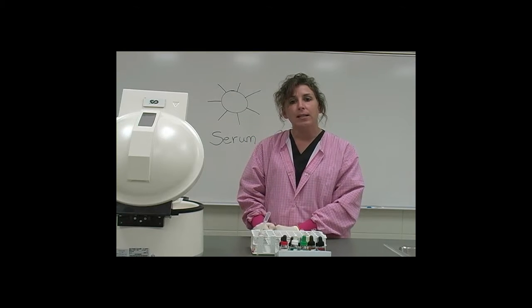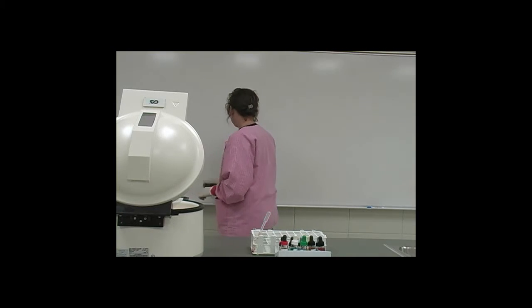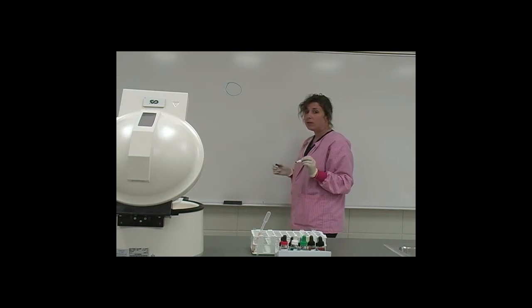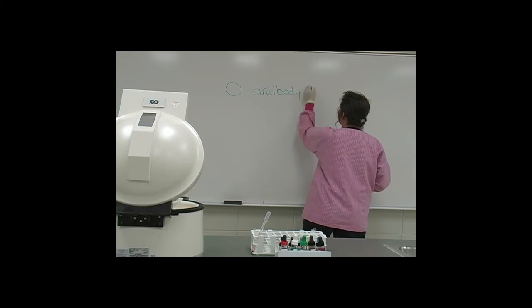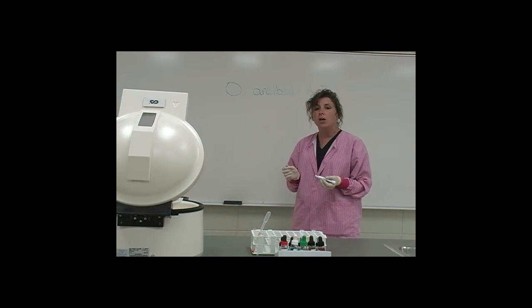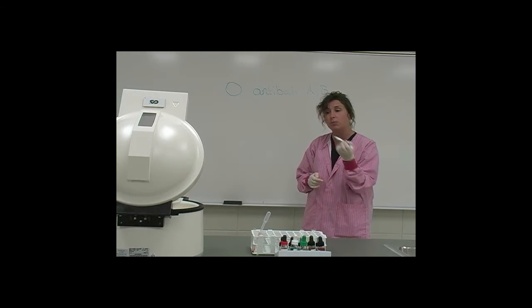So, the way that we depict this is, let's take a look on the board. On a patient who is O, they have in their serum antibody A and B. So those people would not be able to have a transfusion from an A person or a B person. So we would see no antibody-antigen reaction, that lock and key mechanism, so we would have no agglutination, in which we would see a negative tube or just a clear drop of blood.